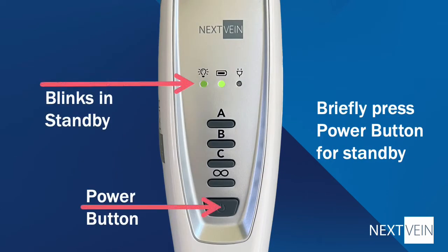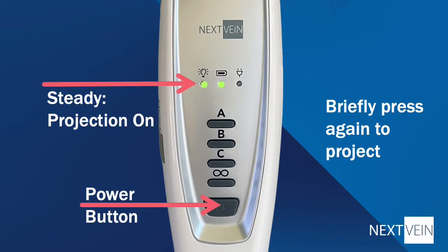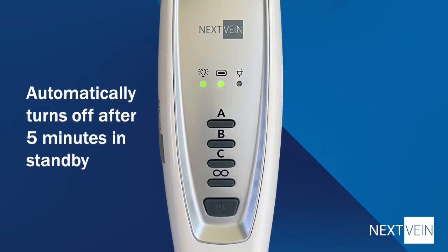The indicator on the right tells you when the device is connected to the battery charger. When you are done using the device, press the power button. The power indicator will begin blinking to let you know the device is in standby mode. Pressing this button again will turn the projection back on. Standby is useful when you want to preserve the battery and still want to be able to quickly turn it back on. After the device has been in standby mode for five minutes, it will turn itself off.